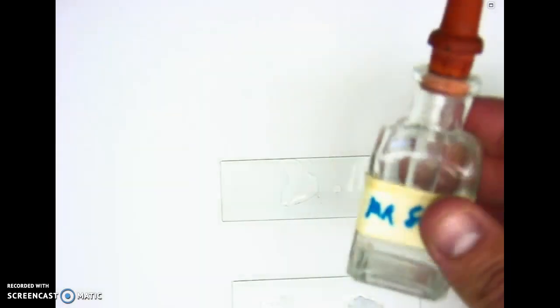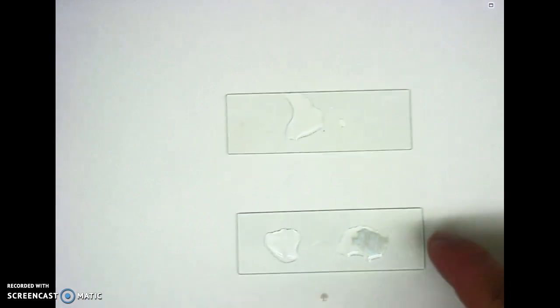So again, I have to interpret that. What does that mean for the blood type? Does he have positive or negative blood based on that information? So you're going to do that. This is a tricky lab. It's more time consuming to analyze the data than it is to actually just put drops of the different letters onto the different slides. So to recap, you only need 4 slides to start.